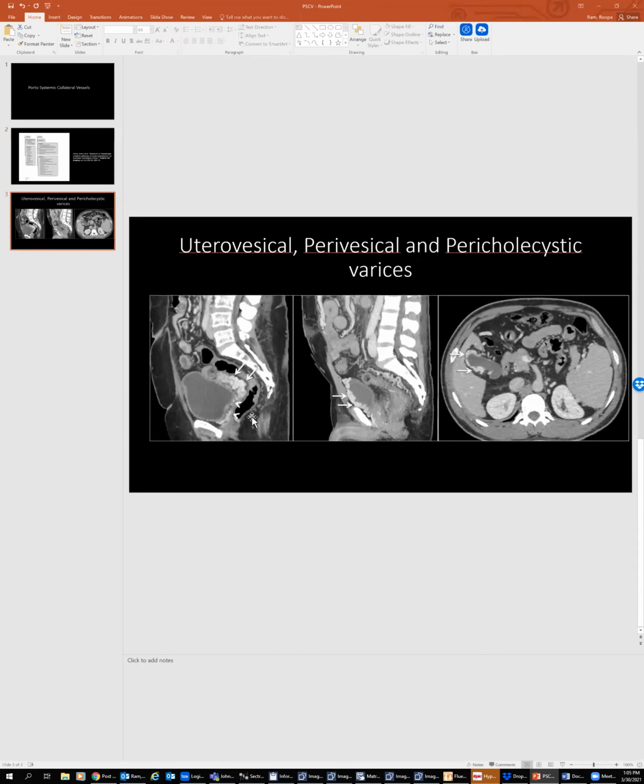They said this is much more common in patients who've had a hysterectomy before because the uterus is not there to divert some of the blood flow through the iliacs into the IVC. They end up pooling at the vaginal apex, forming these huge varices. So these patients can present with unusual manifestations, either vaginal bleeding or hematuria, but all attributable to a common cause we see every day, cirrhosis.